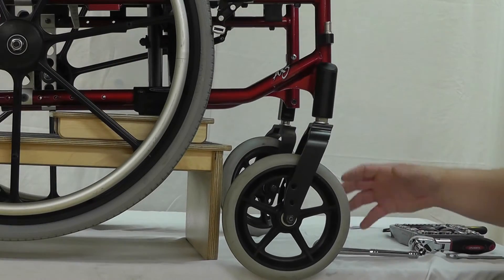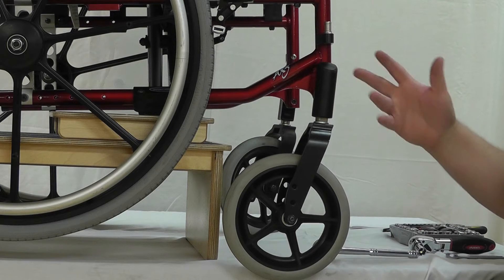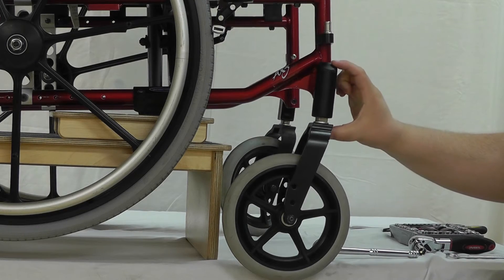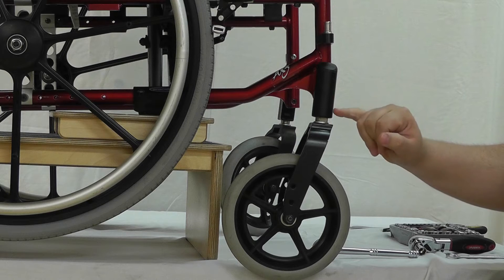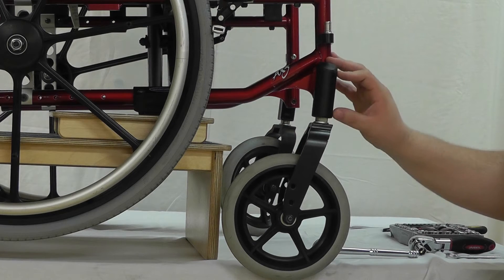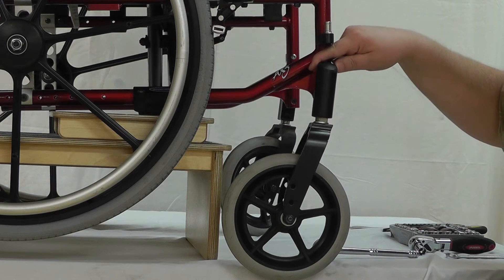You know that problem with the front caster — the wobbly caster, the shopping cart caster, buggy wheel. Right here above the fork there is a large bolt and it's the whole bolt assembly. Sometimes you get the shopping cart caster problem because the bearings in here are old, worn out, they've lost their packing grease, or the entire assembly has become loose.